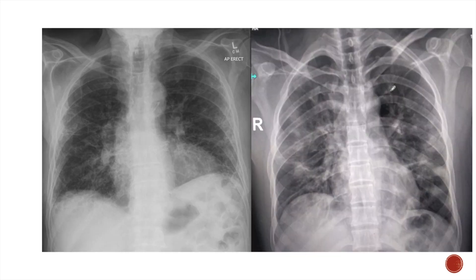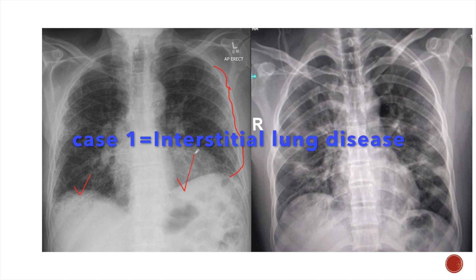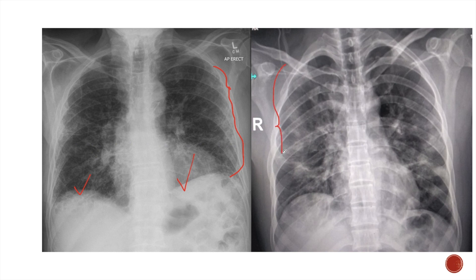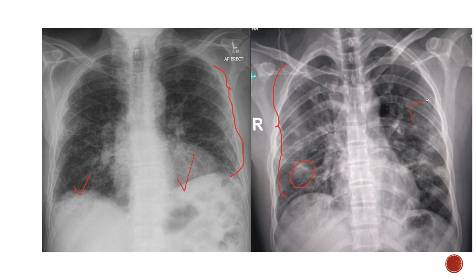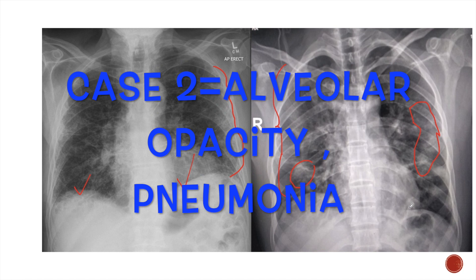Coming back to our initial query: in the first X-ray we can see multiple net-like opacities in both lungs which do not tend to coalesce, and are bilateral and more or less symmetrical. These are interstitial opacities, and this is a case of interstitial lung disease. But in the second X-ray we can see multiple opacities that tend to coalesce and form patches. These are bilateral but asymmetrical, and these are alveolar opacities. This is a case of viral pneumonia.